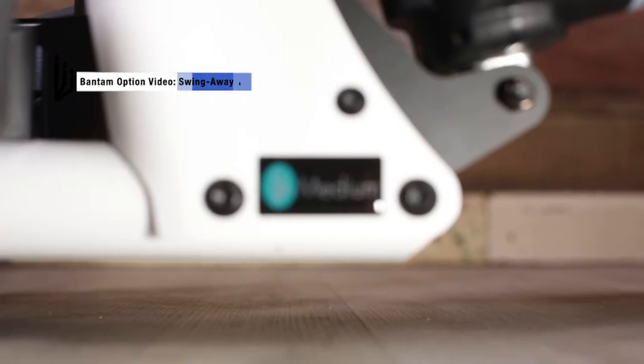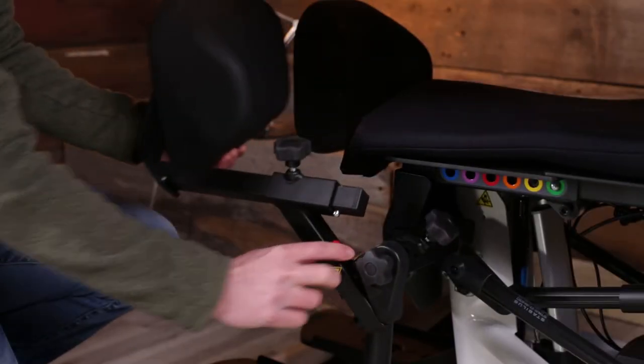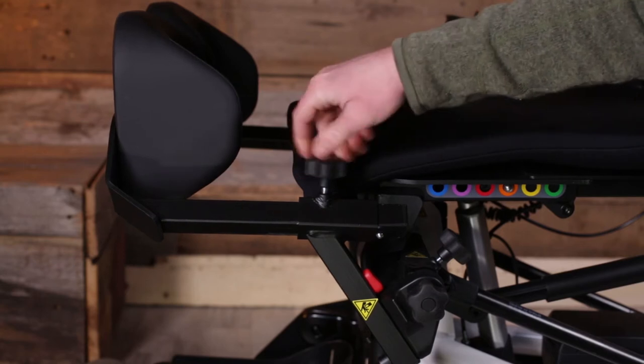The Bantam Medium has multiple options available to make transfers more manageable. The swing-away knees are a great example — with the push of a button, the knee pads swing away, providing more room for transfers, and are easily put back into place and lock into position.